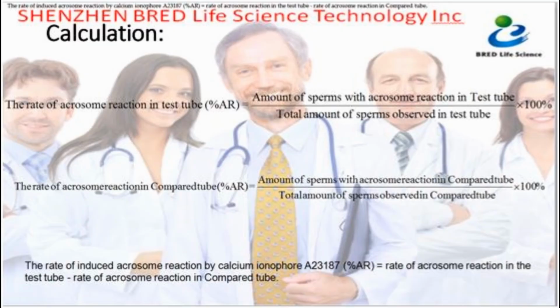Calculation. The rate of acrosome reaction in test tube, percent AR, is amount of sperms with acrosome reaction in test tube divided by total amount of sperms observed in test tube times 100%. The rate of acrosome reaction in compared tube, percent AR, is amount of sperms with acrosome reaction in compared tube divided by total amount of sperms observed in compared tube times 100%.